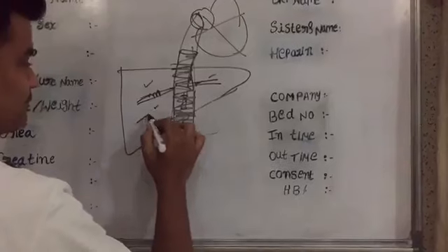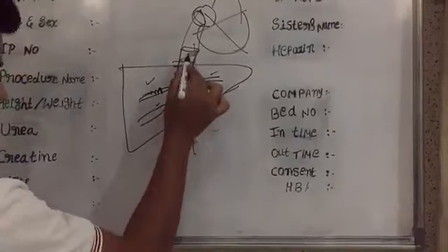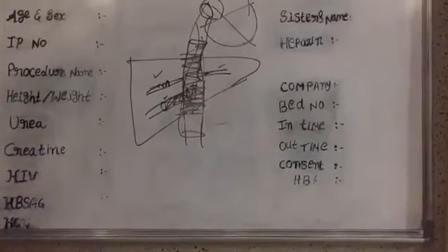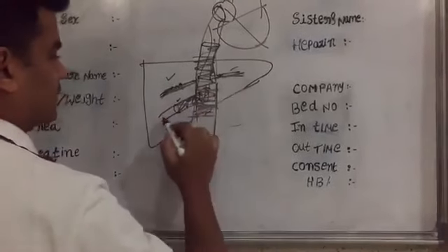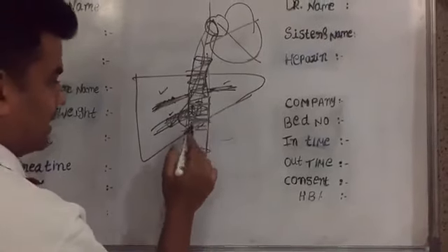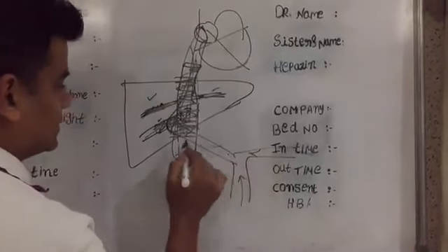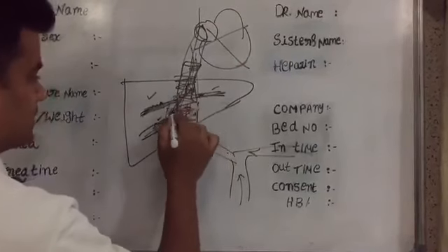But if you have hepatic venous disease, then probably you deal with the ostial stenosis, then you come inside here and do angioplasty and stenting of the hepatic veins, so that is going to be good enough. But in some cases, all the hepatic veins have been occluded completely throughout their course. Then you have to make a TIPS into the portal vein. So this is the splenic and this is the superior mesenteric, this is the portal. You do a stent graft from the portal vein into the IVC, that is called DIPS.